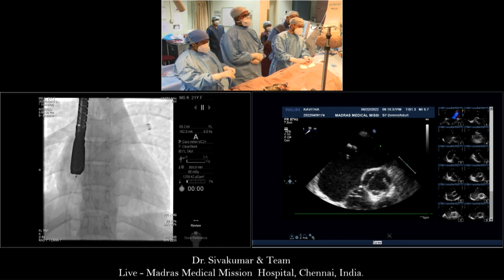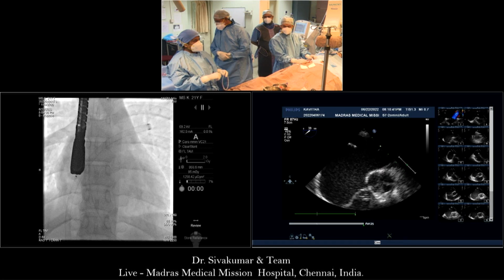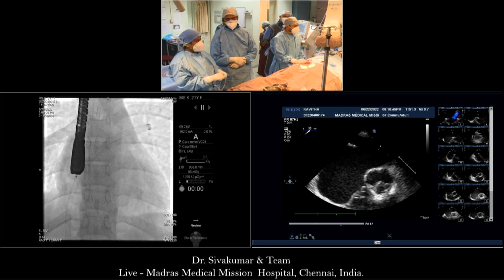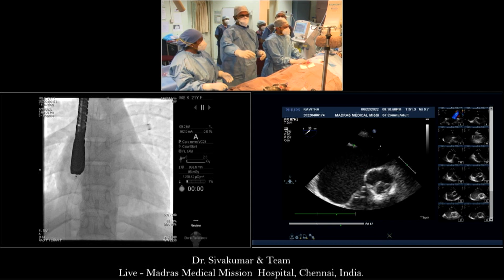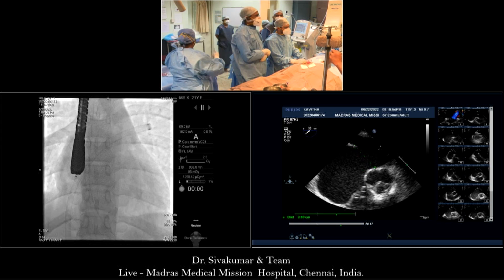In atrial diastole, you have to measure in atrial diastole, not systole. I don't have any ECG connectors. You can tell when the atrium gets bigger. Okay, that's it. Measure that. This is a great case. This is a fantastic, very good thing. Shiva, this is a fantastic case. Thanks for choosing this.